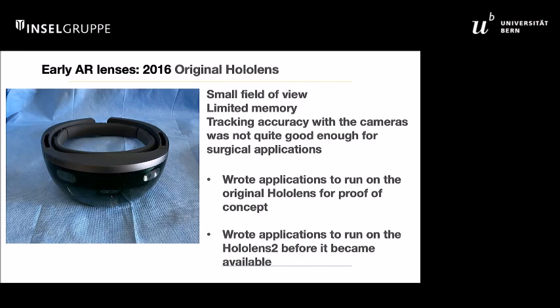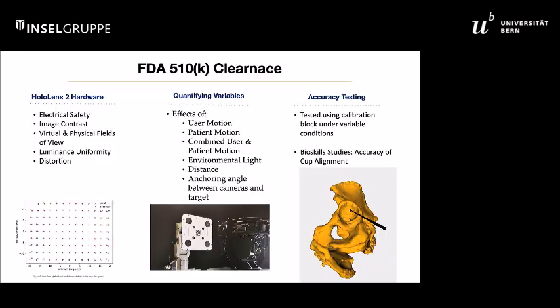But the nice thing about the HoloLens originally is that you could work out the software development, you could work out the workflow, you could start your testing algorithms, and then Microsoft published the software development information for the new HoloLens 2 before it was available. And so this allows you to write code for the device before the device exists, which is nice because then you have the code ready to be installed as soon as you get the actual hardware. So in terms of what you have to do, in surgery it's very simple. Regulatory-wise, not so much.